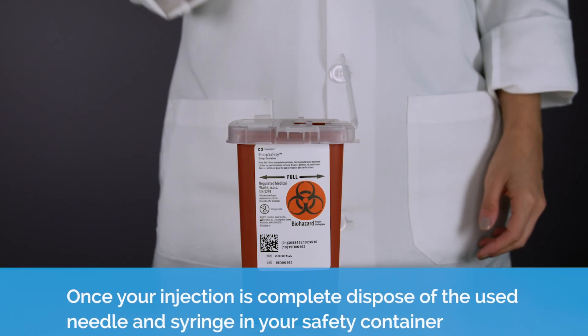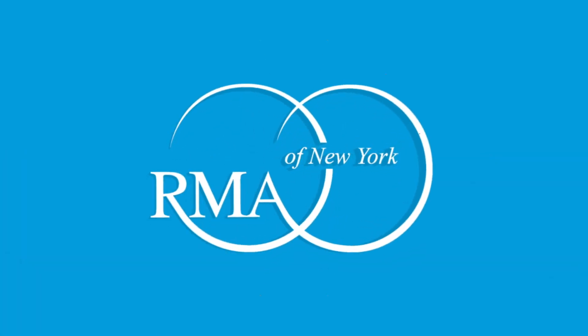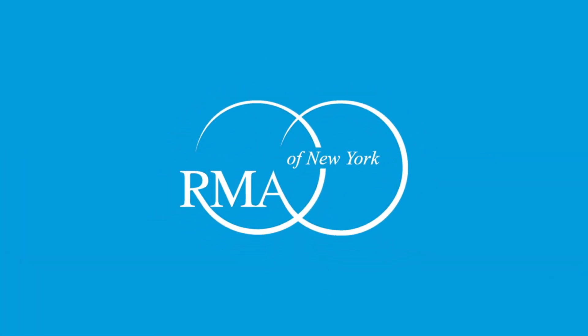Once your injection is complete, dispose of the used needle and syringe in your safety container.